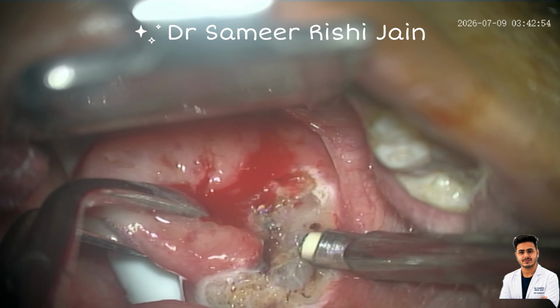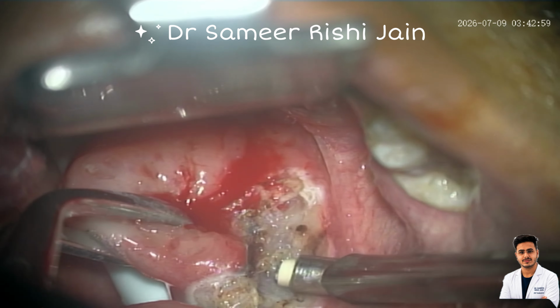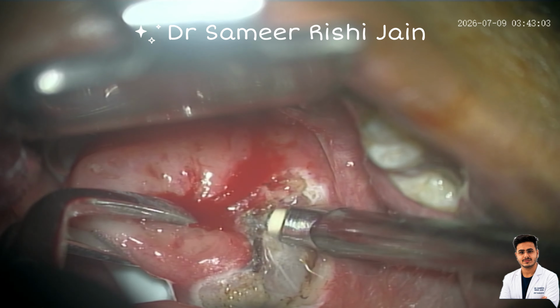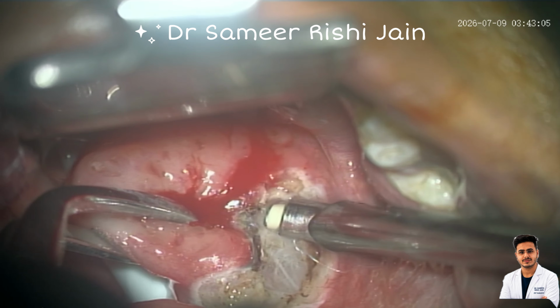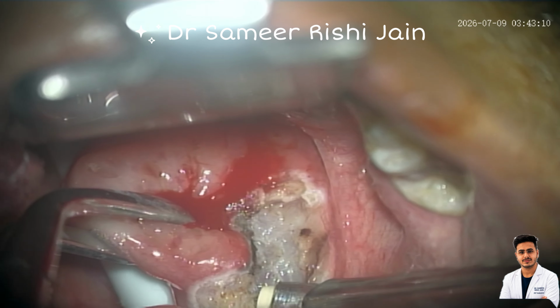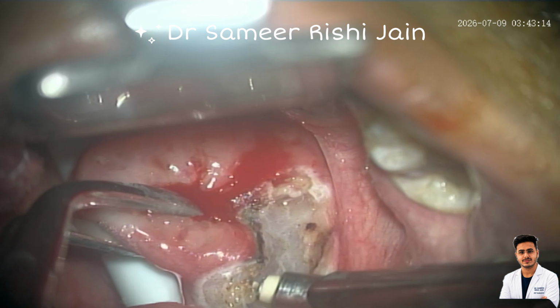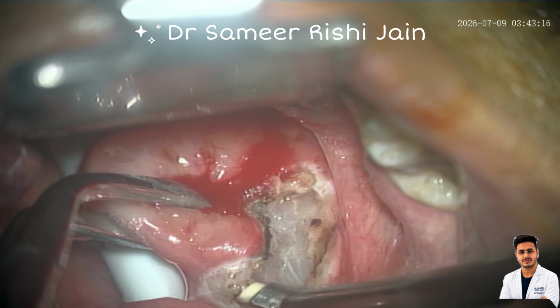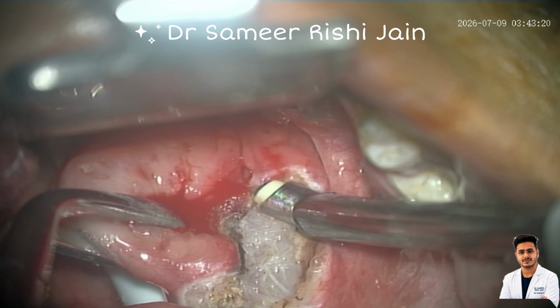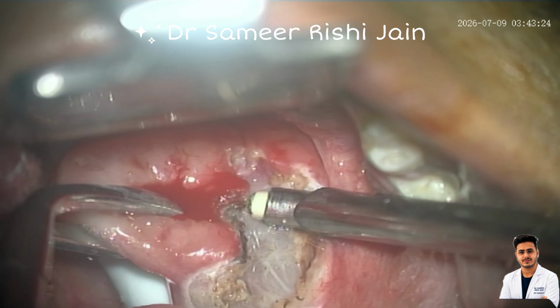We can also go a little lateral to the pillar to find out the correct plane of the dissection. It is very important to find the avascular plane for our dissection, as if we do not find the correct plane, we will leave the tonsillar tissue behind and it will lead to the recurrence. We are at the upper pole and the tissue is more firmly adherent at the upper pole and the lower pole.